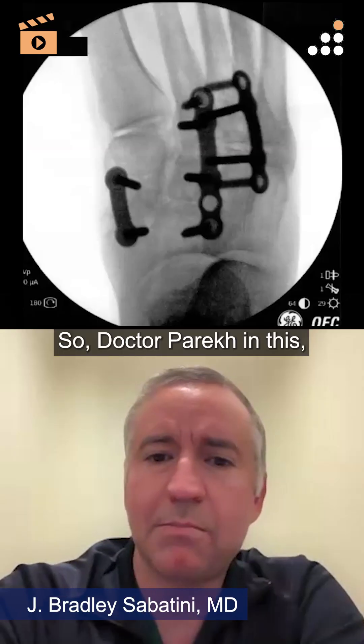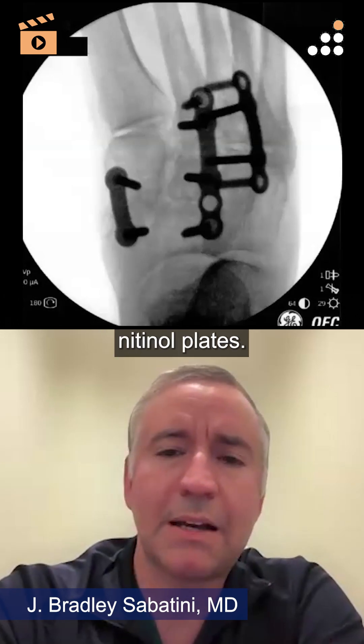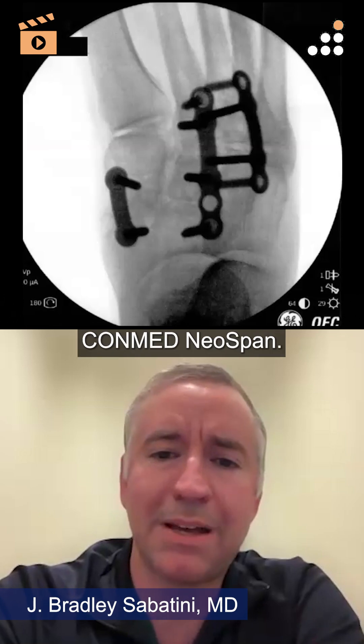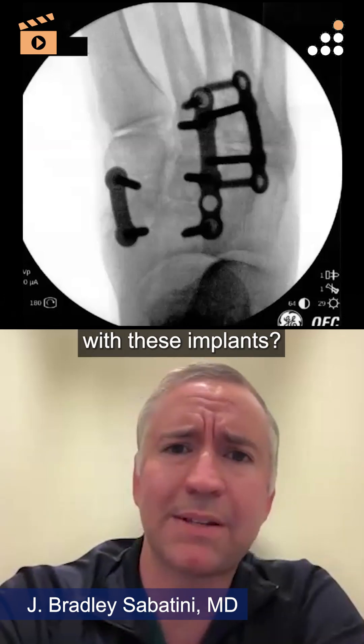In this midfoot fusion, I elected to use nitinol plates — compression plates, specifically the ConMed Neospan CIS implant system. Have you had any experience with these implants?